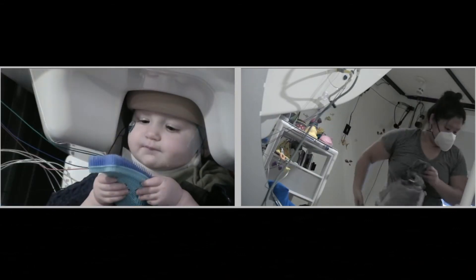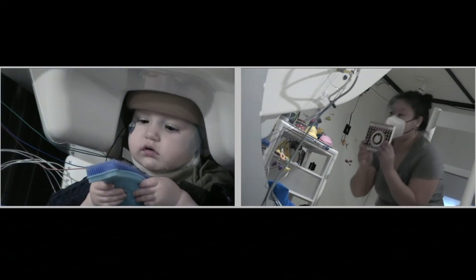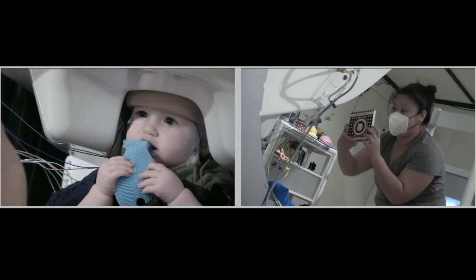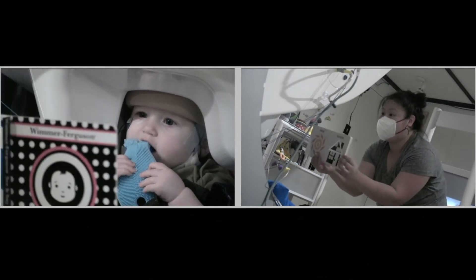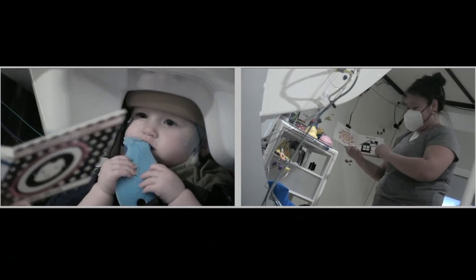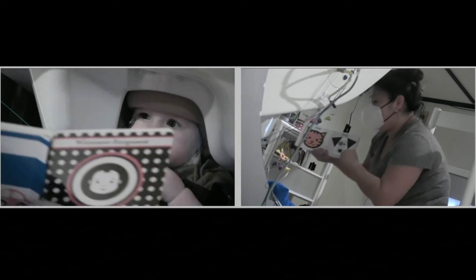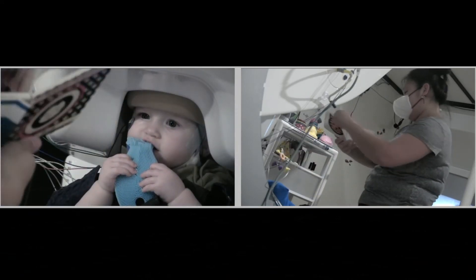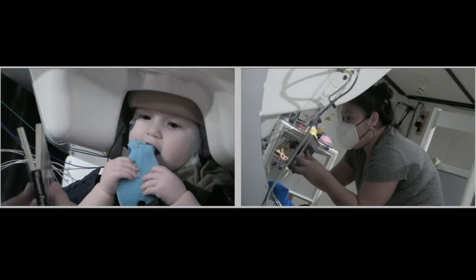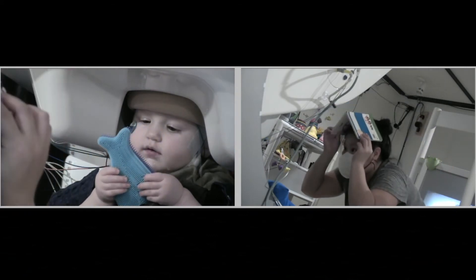For example, when we conduct a somatosensory MEG study, touching the infant or allowing the infant to hold a toy is avoided during trials. Sometimes less is more with regard to toy waving. The infant's attention can sometimes be captivated by a single toy for a long period of time. Other times, the toy waiver will cycle through many toys throughout the session to keep the infant attentive and still. This is largely dependent on the age group and the individual personality of the infant.